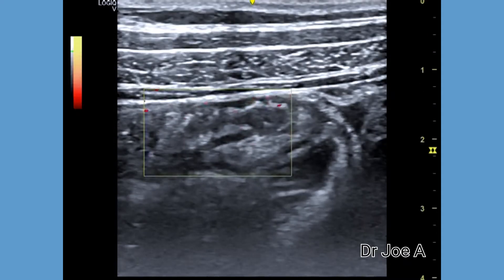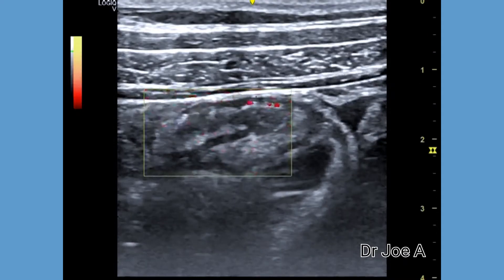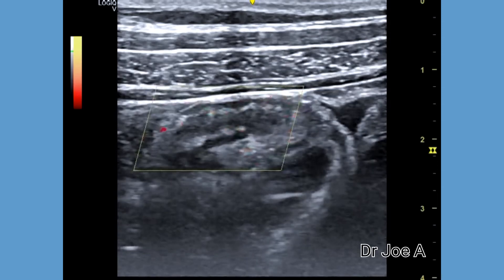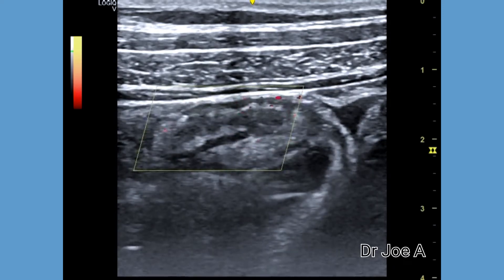Doppler does not show a significant increase in vascularity.